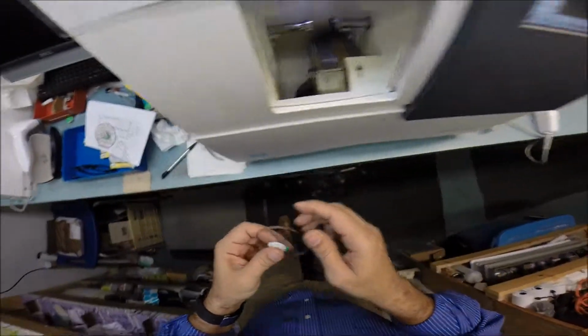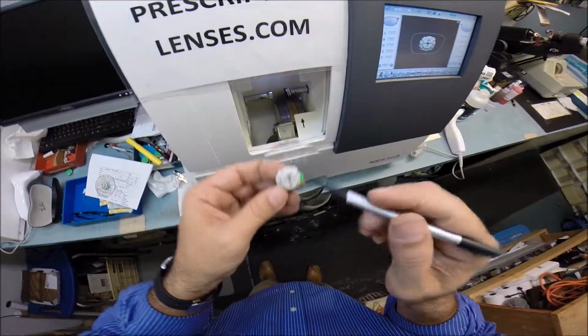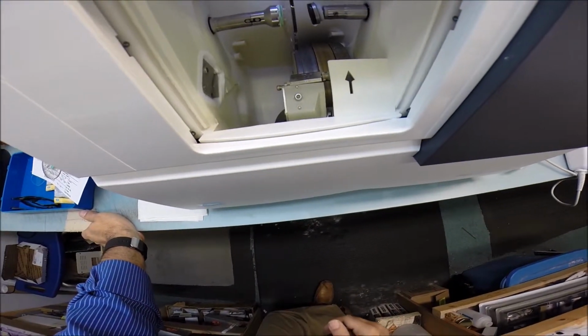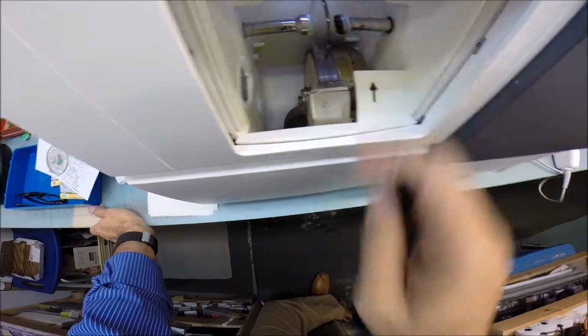But I press it on there firmly. The actual cutting wheel is over here on the far right. It's a heavy grit wheel that's going to grind away your polycarbonate lens material to its final shape. Again, this little silver tab is a magnet which will hold it in place in the chuck, or as I like to call it, the Charles, because I don't know it well enough to call it chuck. But I will put that there.